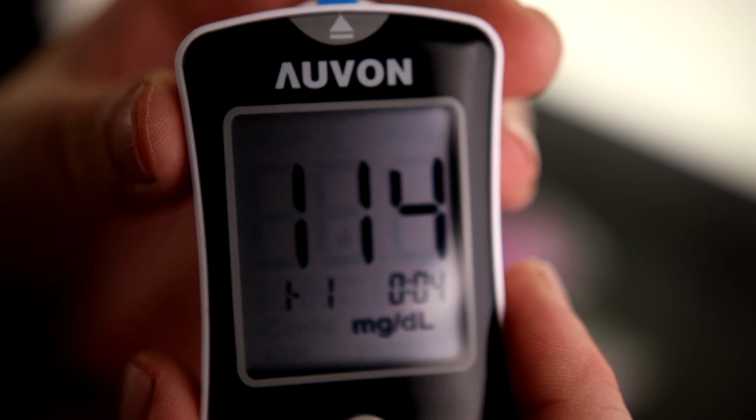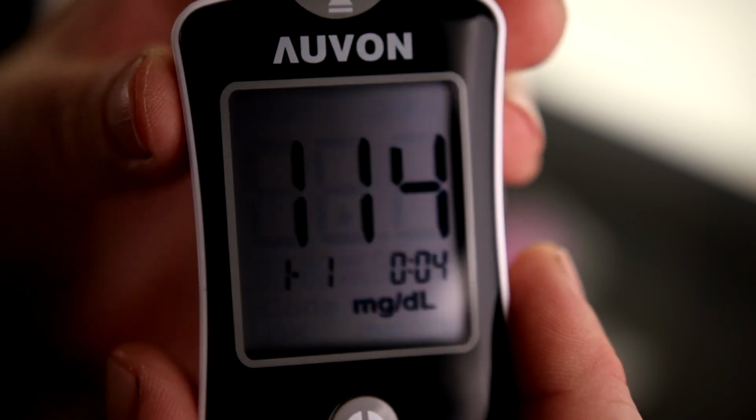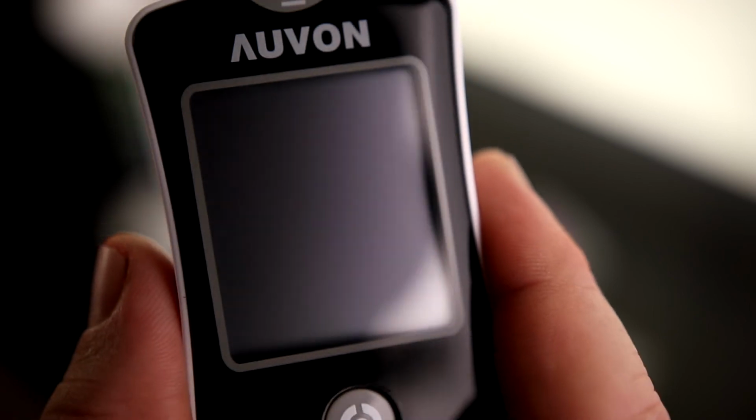And 114. So there you go. Nice and quick, real easy to use. Basically does everything for you. So now we just pull this guy out. It'll shut off and it's ready to use next time.